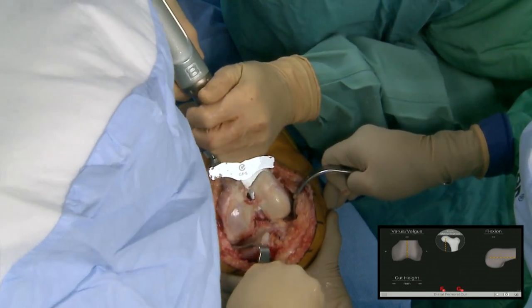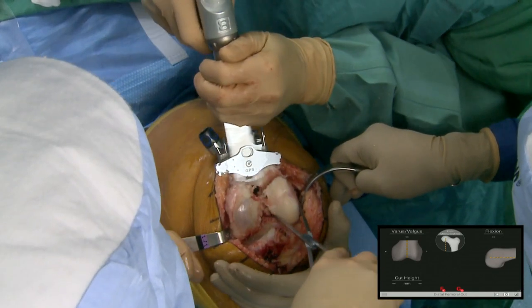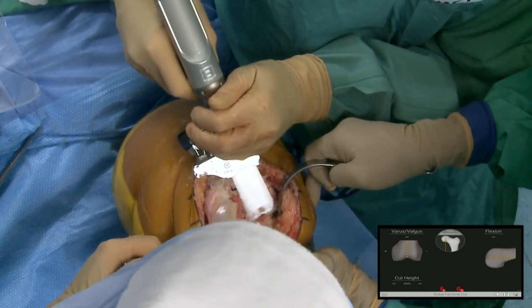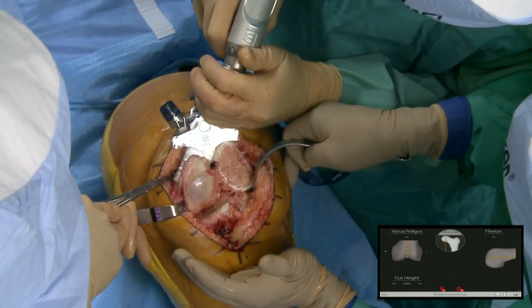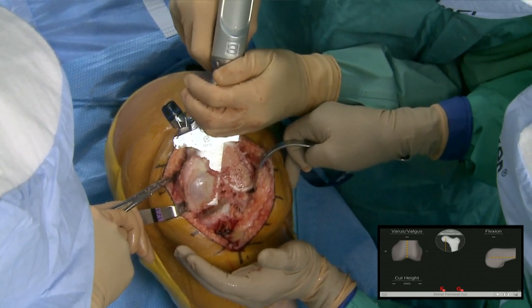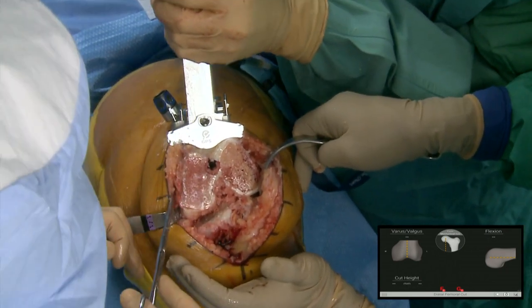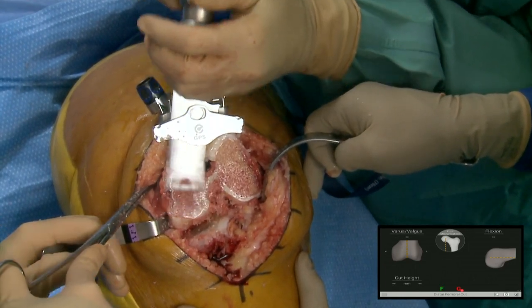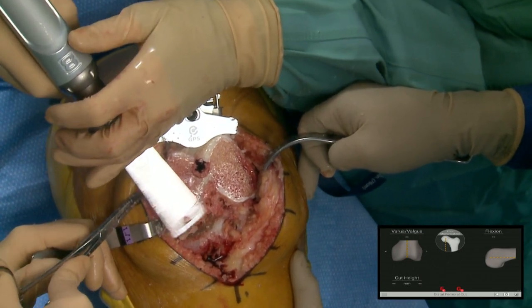This is where I'm nervous — yesterday you did the robot cut and knew it would be accurate. When you have a handsaw that you have to hold yourself, that's a different story. Now we'll see how good the human robot is. I'm cutting through the slot. It's a four millimeter difference between the slot and the top — if you wanted to cut on top you'd just adjust it that way.